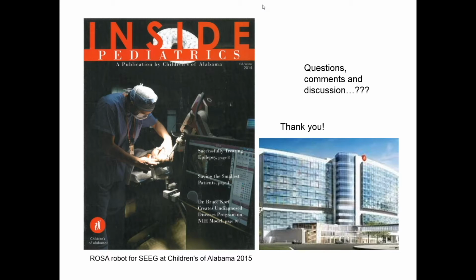Yeah, I think that's an interesting question, because we really do disrupt the environment when we put grids in. Now, that being said, kids with mild epilepsy don't go for invasive investigation. Matt Smith at St. Louis and I looked briefly at this in kids: when do kids with grids seize? And if you don't seize with a grid within about 3 days of having your grid placed, the likelihood that you're going to seize within 17 to 20 days is single-digit percent. So with a grid, you better seize early or you're not going to, because that gets to be a practical question.